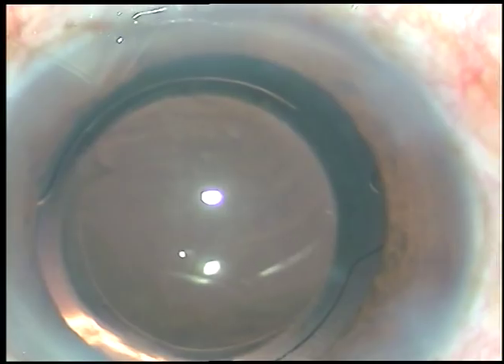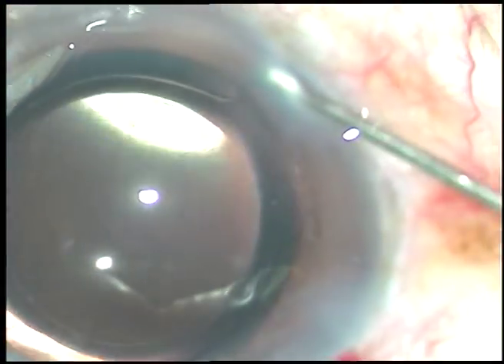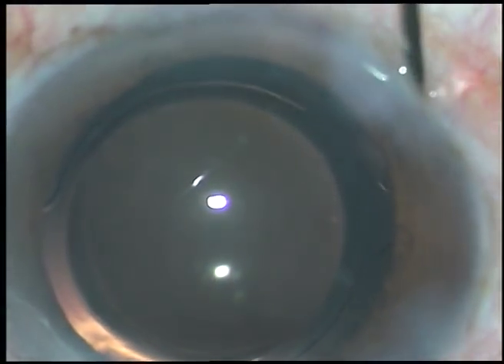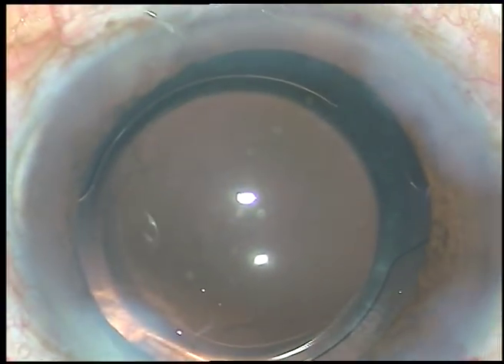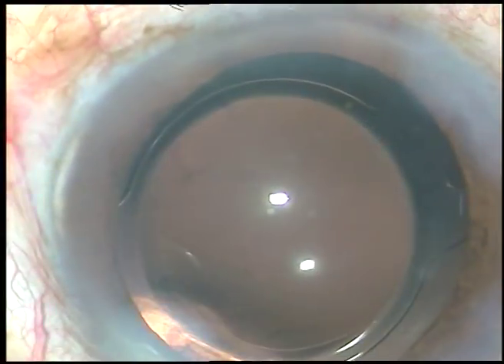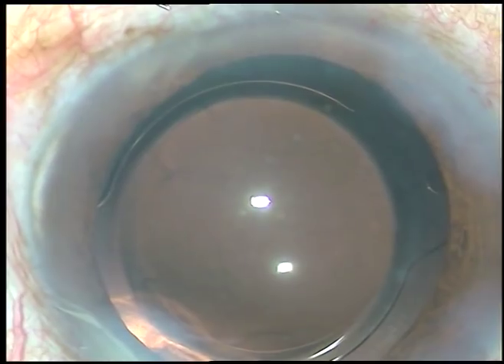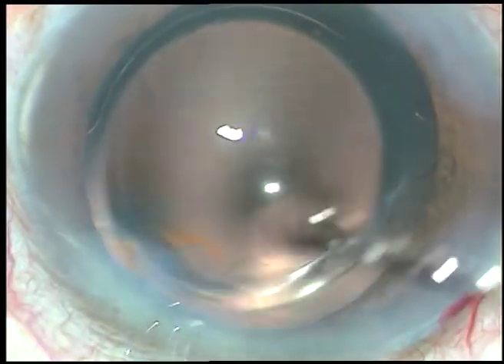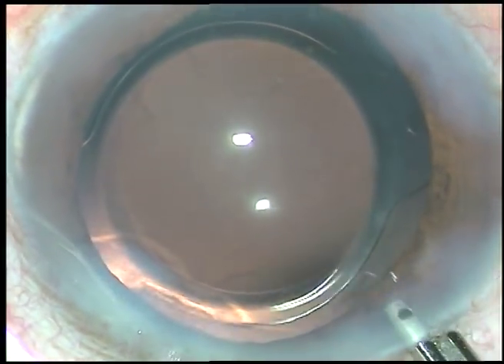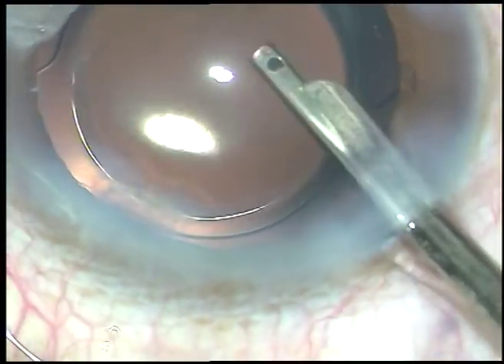A bit of moxifloxacin is injected. The side ports are to be closed — the stromal tissue on either side of these stab incisions is hydrated, the stroma becomes thick and these stab incisions close and become watertight. This is the final lavage of the anterior chamber.